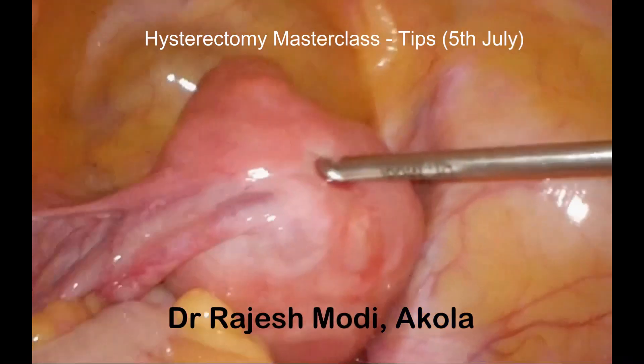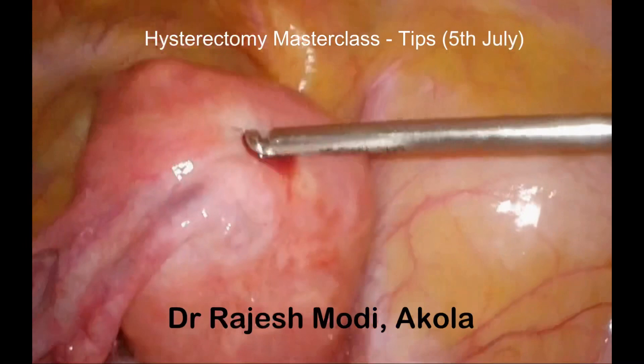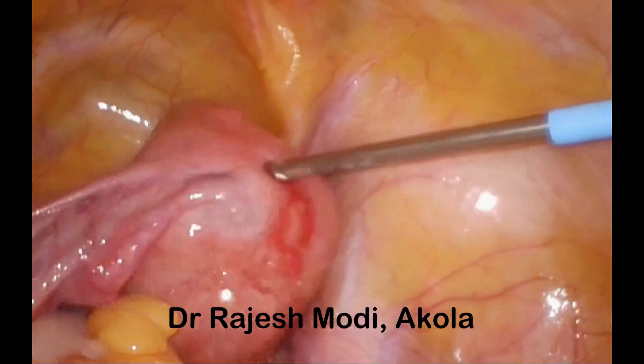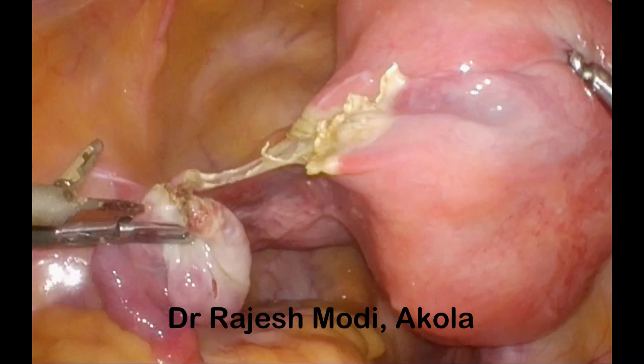The simple concept is: lift the uterus up — do not pull the uterus up. When you pull on the uterus, you are likely to avulse. Lifting is different. When you pull, the myoma screw is in line and it will avulse, but when you lift, the tangent of the traction is different, so the myoma screw is less likely to slip out.